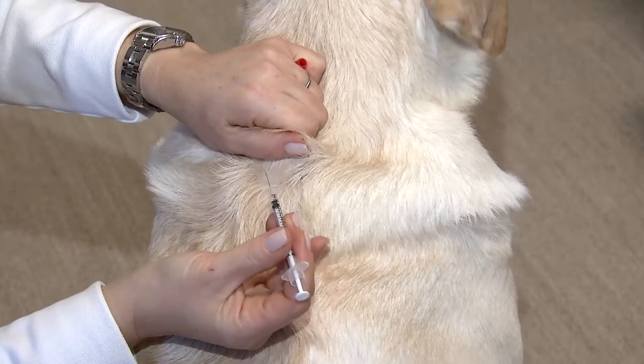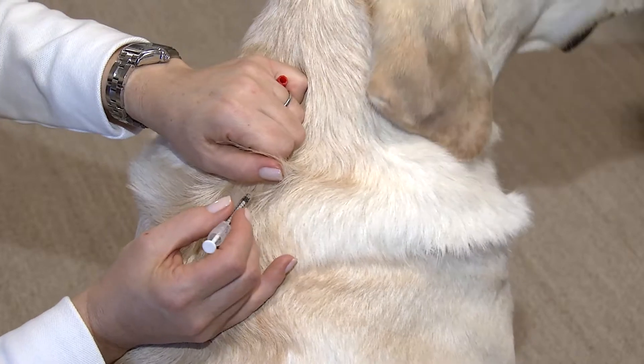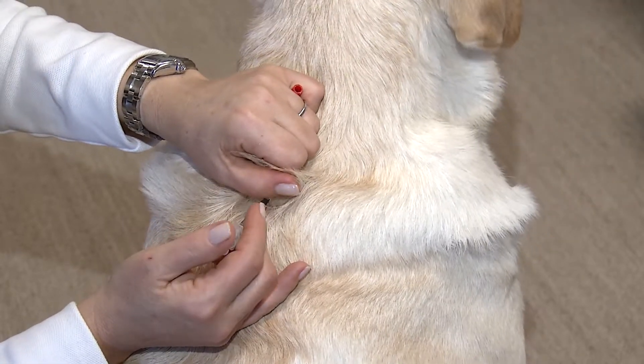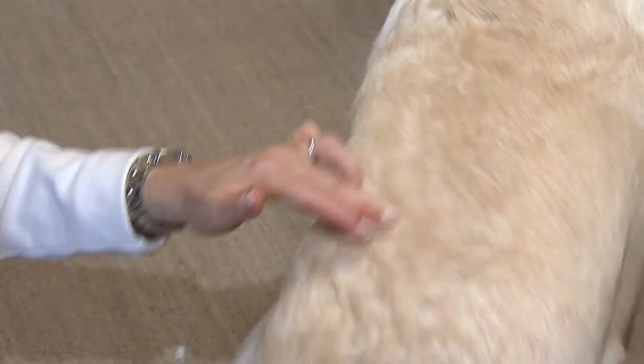Hold the syringe by the barrel, go into his skin, and once you're through, go ahead and push the plunger. Once you're done, come out and the injection is over.